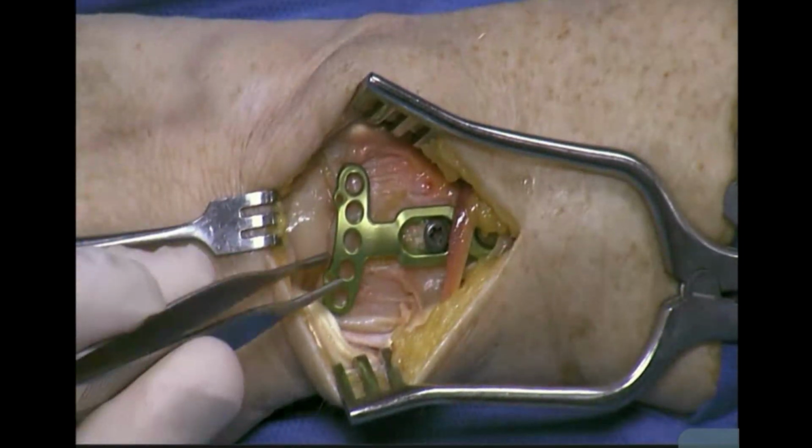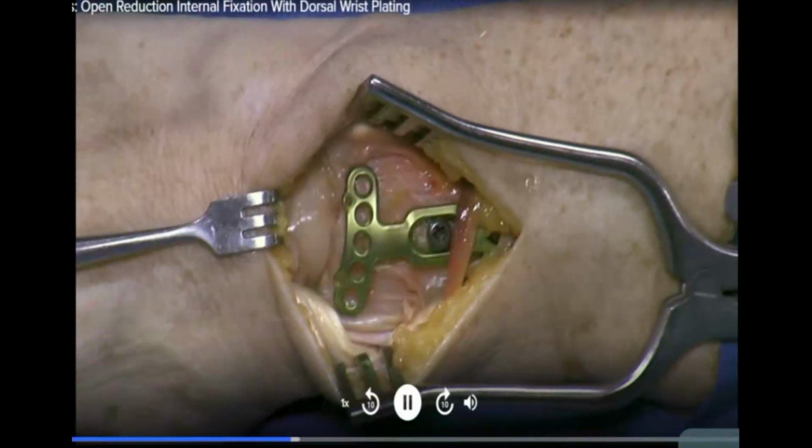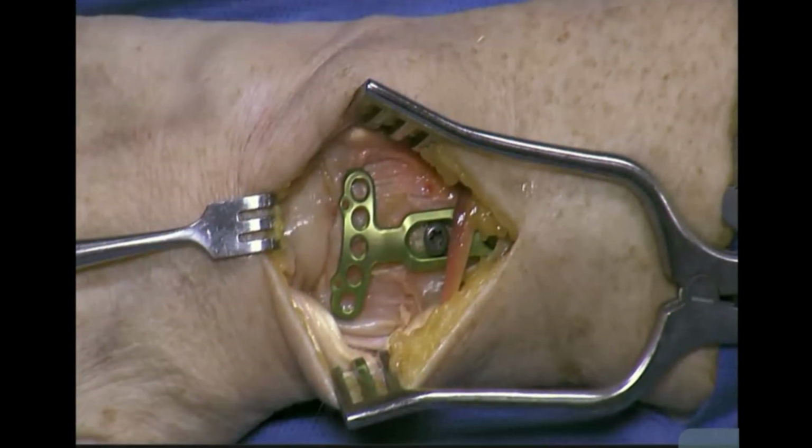And then before tightening this, we want to make sure that we've got the distal portion of the plate where we want it in relation to the joint.